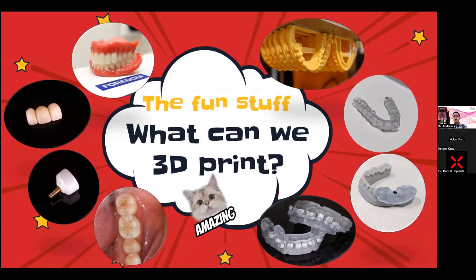Then splints, okay? Very easy to do, very predictable, great materials out there. A fantastic way to get your return on investment on a 3D printer. Surgical guides, we'll talk about them a bit later. Indirect bonding trays, then going clockwise, printed restorations and dentures. So a lot of applications that we can 3D print.